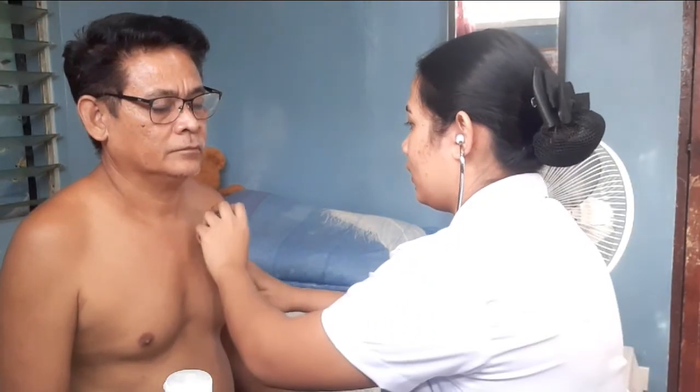So the next thing that we're going to do is auscultation. Here we'll be needing our stethoscope. So what are we going to auscultate? We are going to auscultate the anterior breath sounds and adventitious breath sounds. Okay, so I'm going to check it here. Just breathe normally, okay?